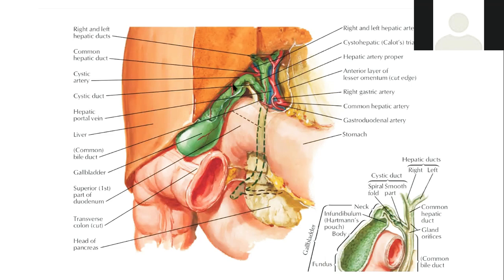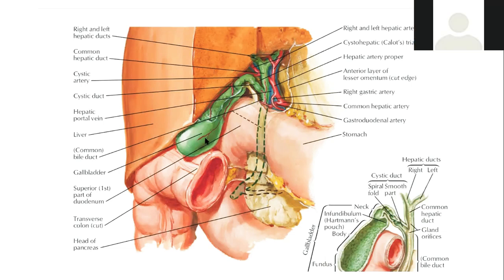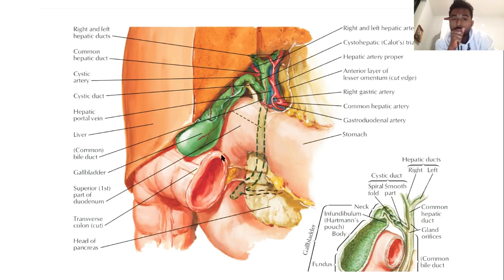I know on the actual body, this is a true sagittal. But think about the gallbladder: if I'm going straight like this, I'm cutting this, I'm getting a transverse view, right? So if I'm trying to get a sagittal view, that's what we do in MRI. If we're scanning the gallbladder, we're going to plan the slices this way. You get what I'm saying?